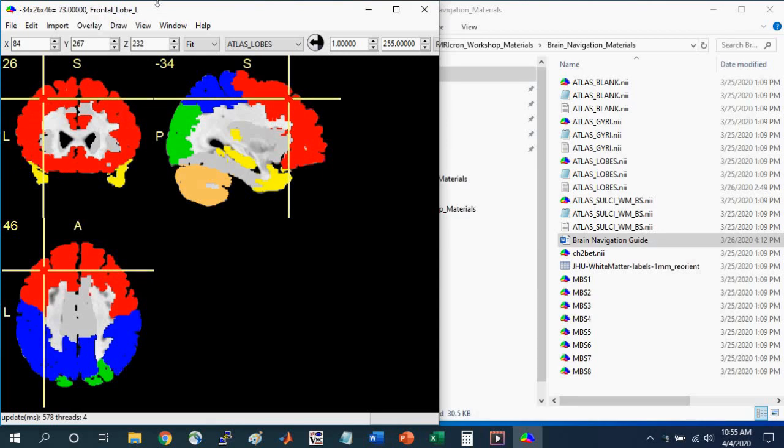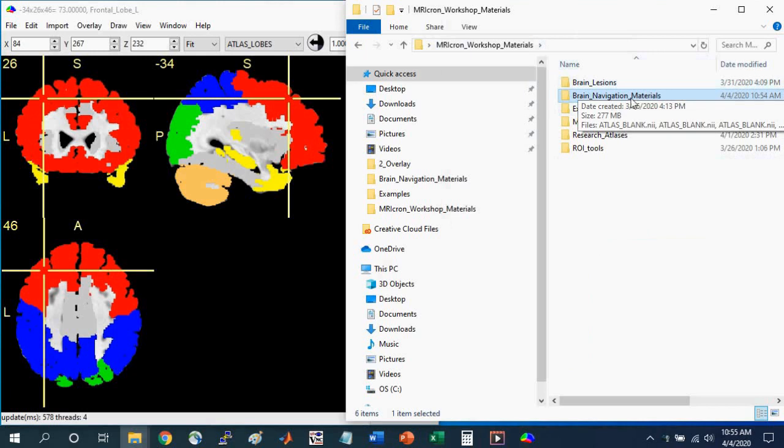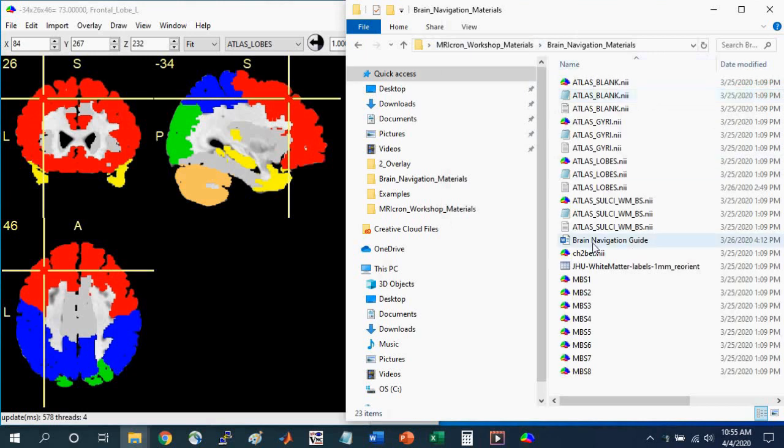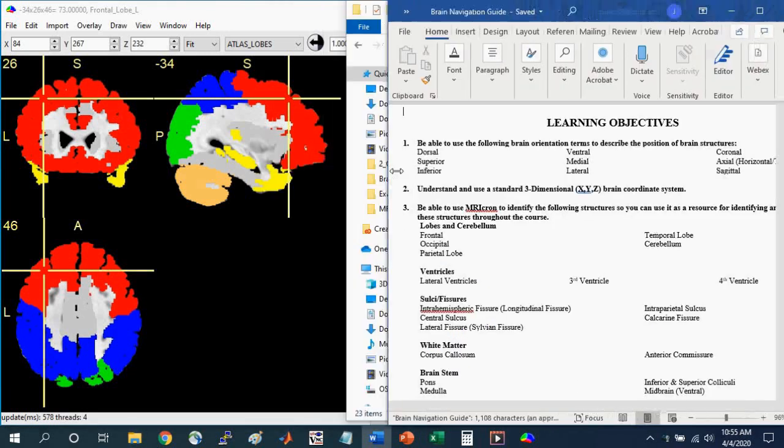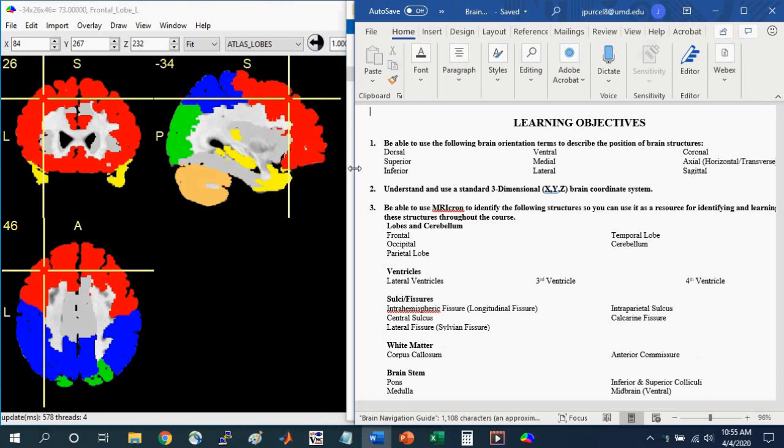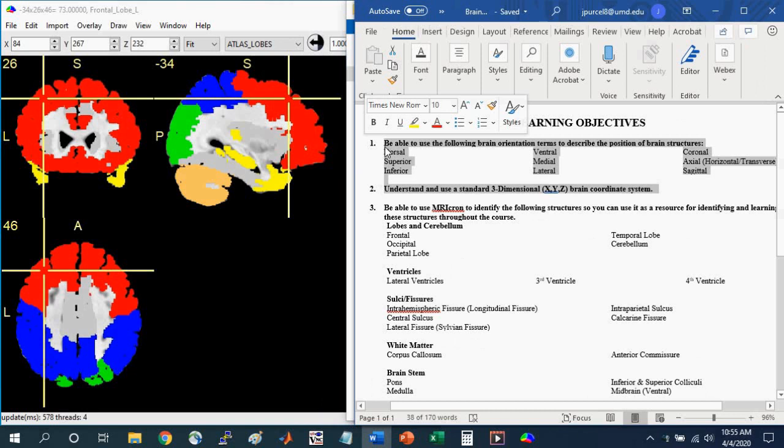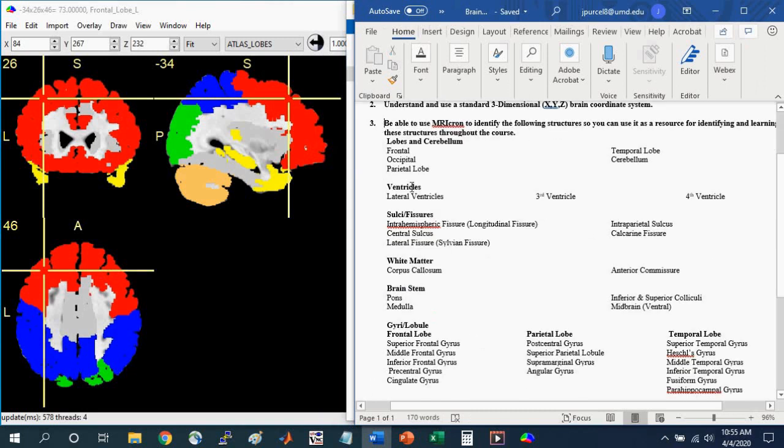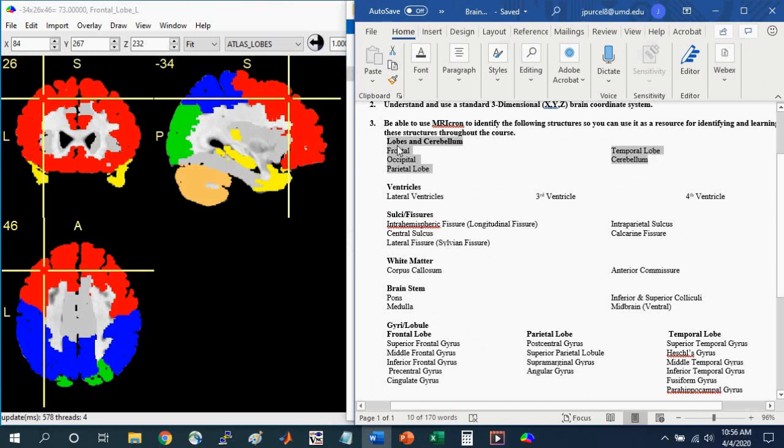Before we go any further, I want you to open the Brain Navigation Guide that comes with these materials. So go into the Brain Navigation Materials folder and select the Brain Navigation Guide. Here are some learning objectives that will help guide you when learning neuroanatomy. Parts 1 and 2 we went over in the Introduction to Brain Navigation with MRI Cron video. Here we're going to focus on part 3, and I'll show you how to use these templates to learn these different brain structures.